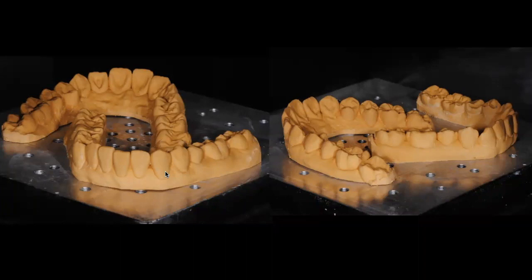There's another reason why I like using that tray. The tray is so thin that when you heat it up, it looks like a balloon, and I'll show you a photo of it. It really becomes very, very soft, so it easily adapts to all the contours that you're seeing here. When you interpose these models the way you're seeing in the photo, very close together but not touching each other, you will be able to fabricate both trays, the upper and the lower, using just one of the soft sheets. That's one really good tip and trick.